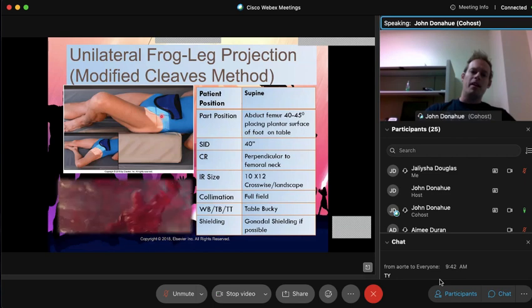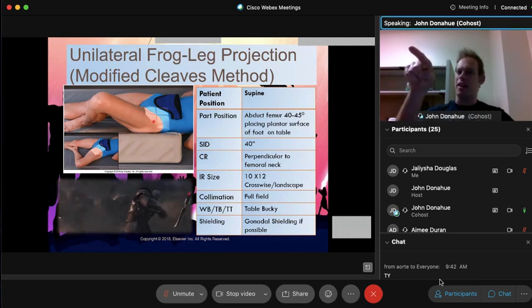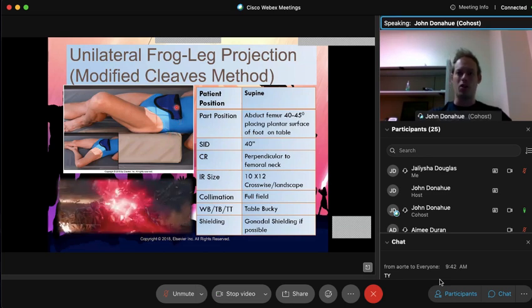But let's say you screwed up your centering because the patient moved on you. One thing that you can do is you'll notice whenever you bend the leg, I wish I could show you guys this in person. It's a little hard to show on this picture. If I was to move this leg back and forth, the leg forms a crease right here at the hip joint. You know what I'm talking about? A crease, a little fold or crease. If you put your crosshair on the crease of the leg, that's going to be the exact location of that femoral neck. So that's not in the book, once again. That's my method. But it's going to give you a perfect centralized location for that frog leg lateral hip x-ray. Works like a charm. Works great.